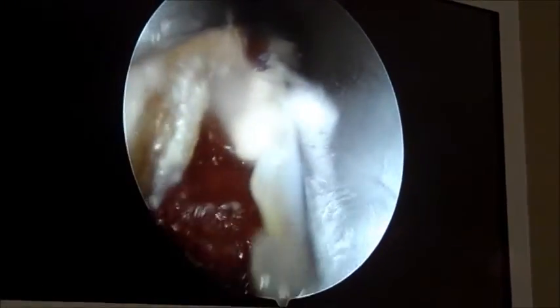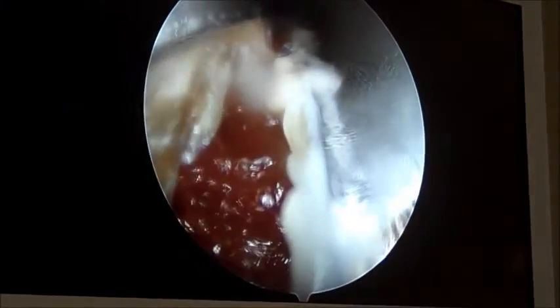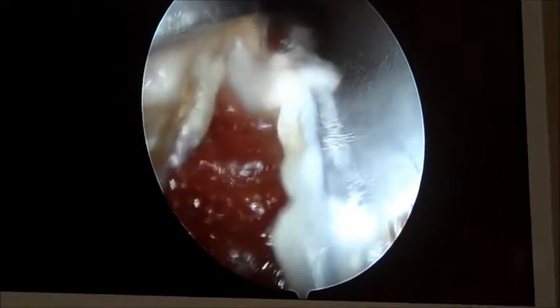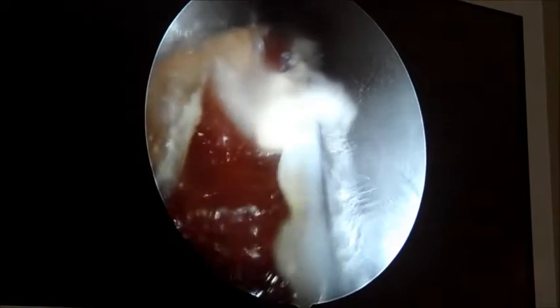You can see here we've completed the cut for the plantar fascia, and you can actually see the deep muscle underneath. What will happen over time is now that band has essentially been lengthened — it will scar at that new longer length, therefore relieving the tightness in that plantar fascial band.